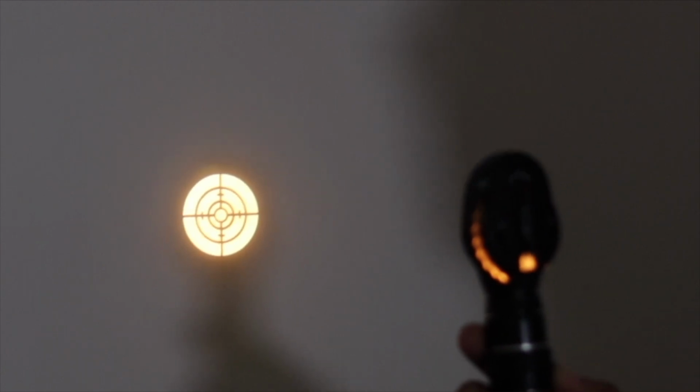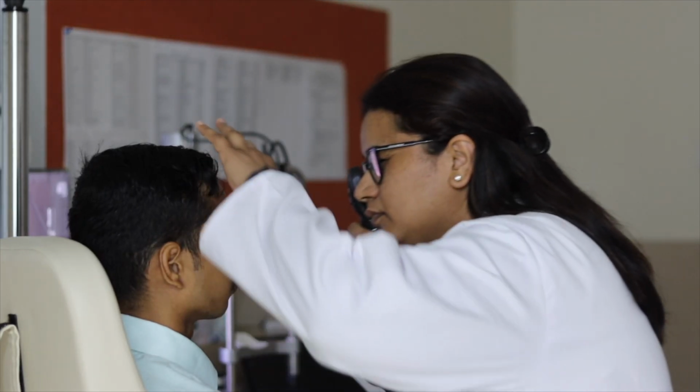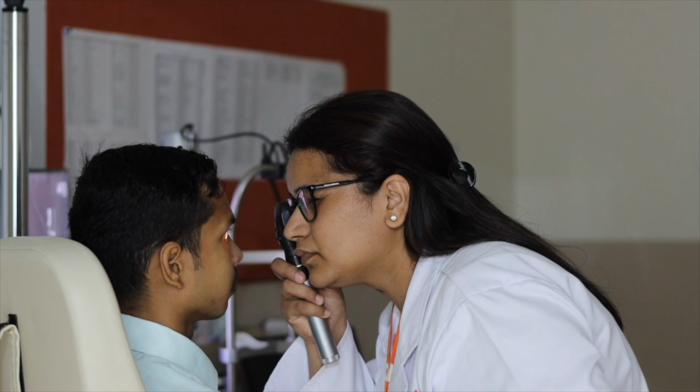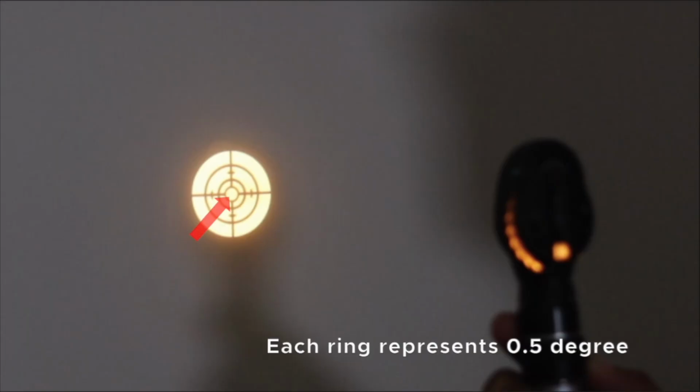Lastly, for assessing eccentric fixation, graticule present in a direct ophthalmoscope is projected onto the macula of each eye separately while asking the patient to look into the central small circle. This point is normally the fovea in a patient with BSV. However, in microtropia, the macular point that takes up this fixation can be parafoveolar. This is how a complete clinical evaluation of microtropia is done.